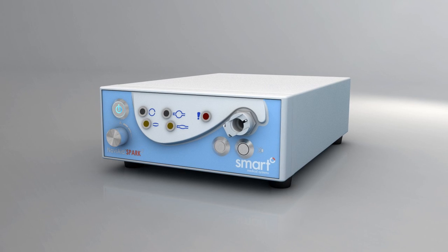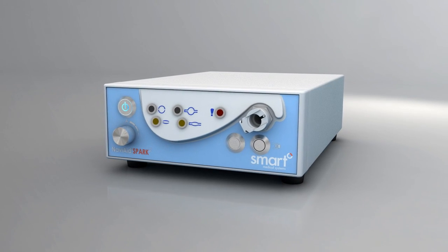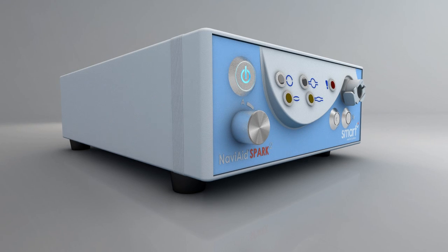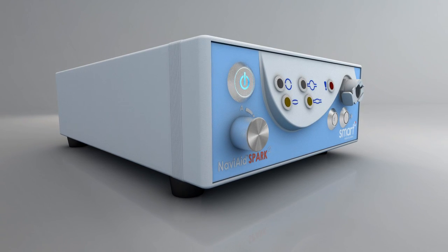Balloon inflation is controlled by the NaviAid SPARK2 inflation system, which may also simultaneously support any of the NaviAid single-use balloon devices.